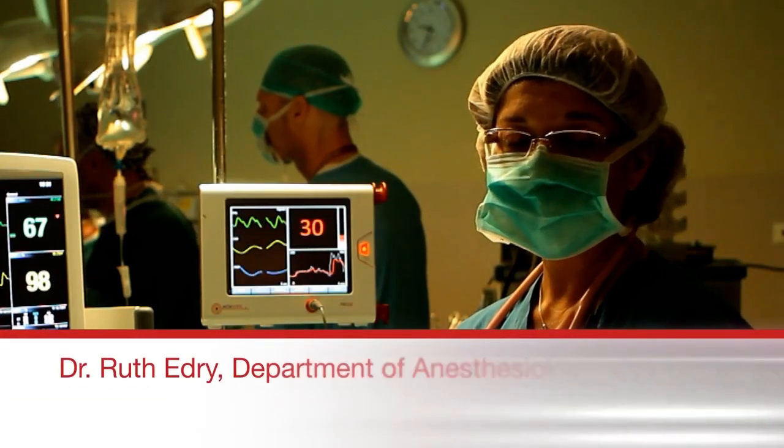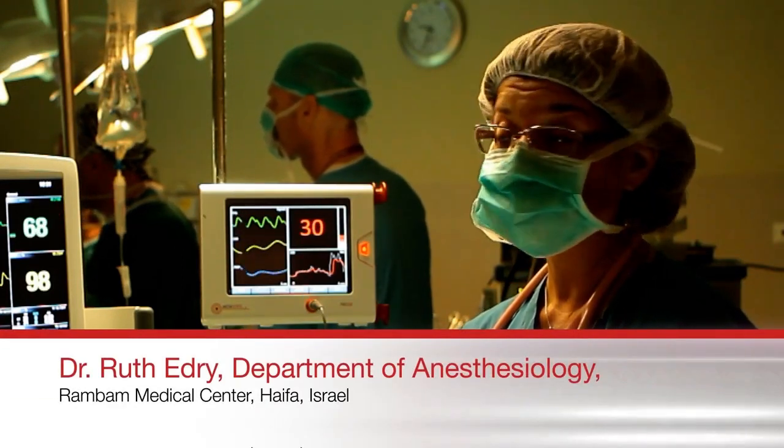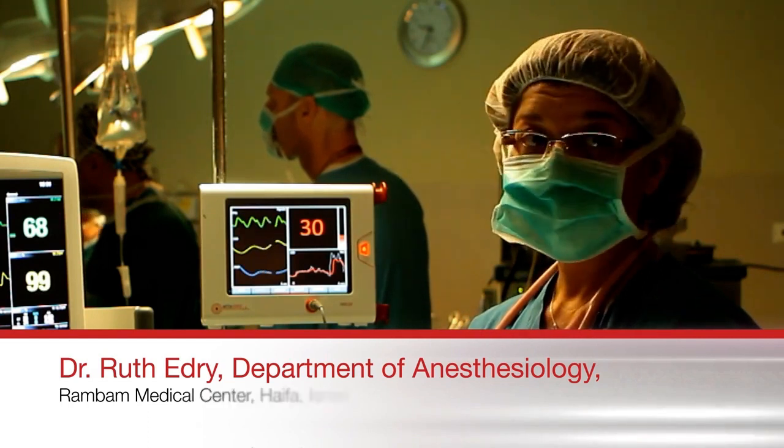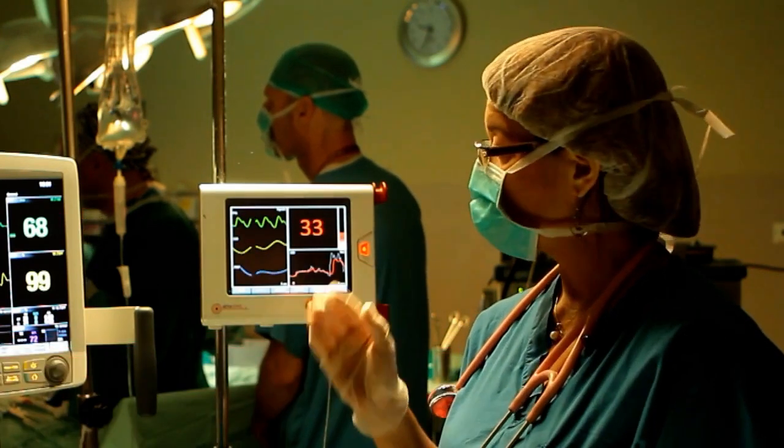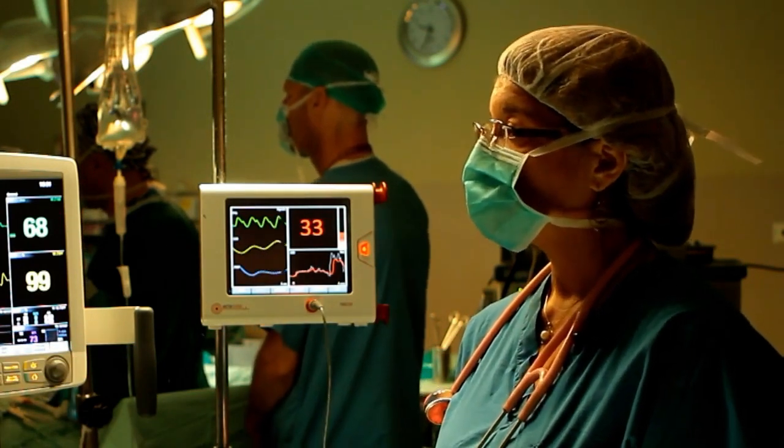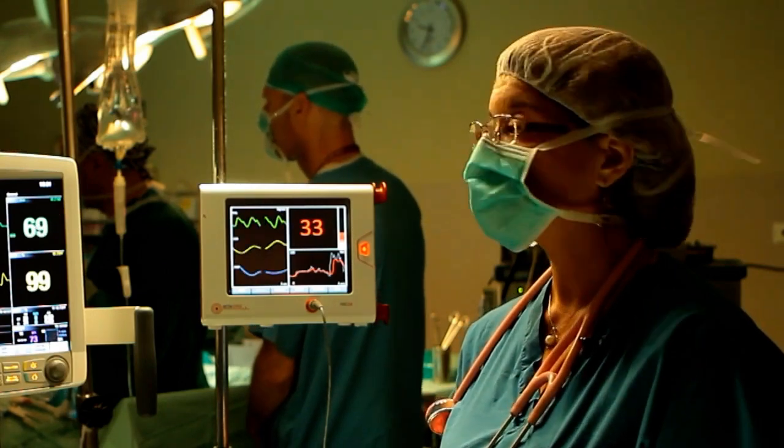Different caregivers treat similar painful conditions differently based on their subjective interpretation of the clinical situation. The NoL allows standardization of assessment and treatment methods.